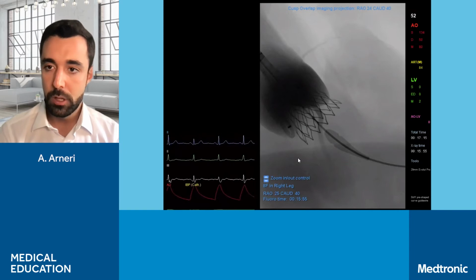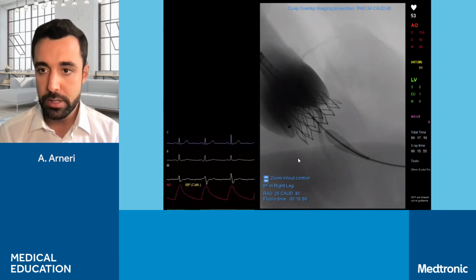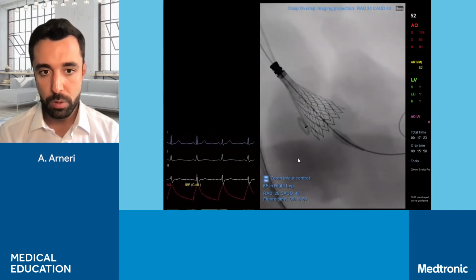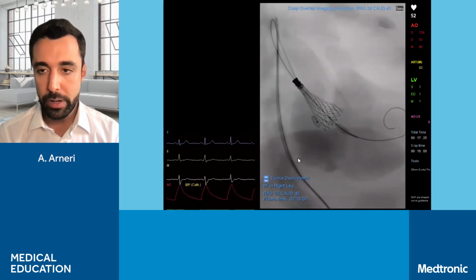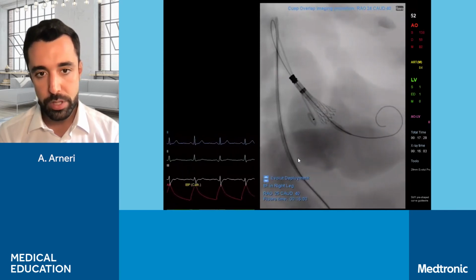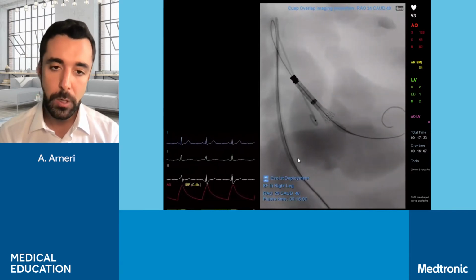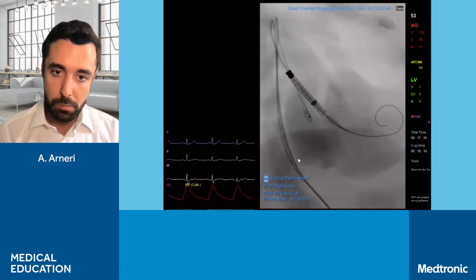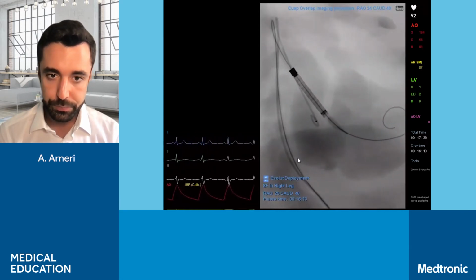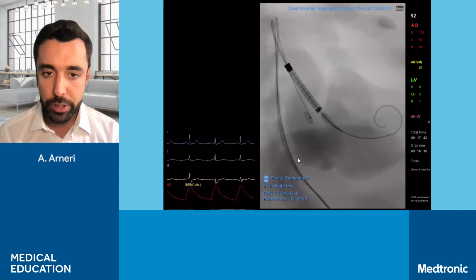So now, also for the sake of the training, we're going to show how to recapture and start over again. So we can recapture now. We don't really need to do any pacing now. We just have to resheath the valve. So it's really simple. We're closing fully the valve. Okay, and we're gonna start over.